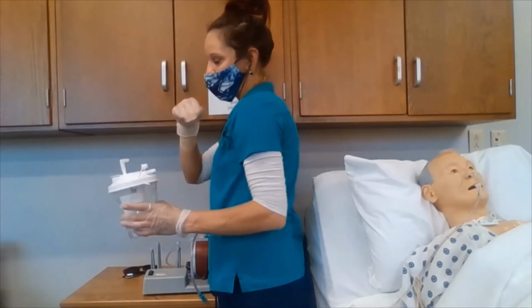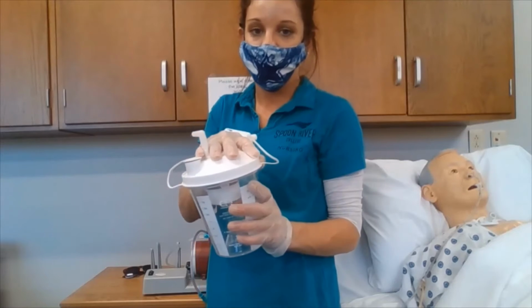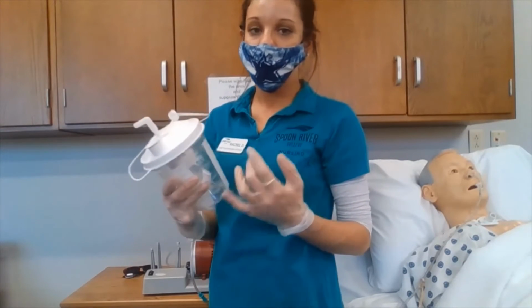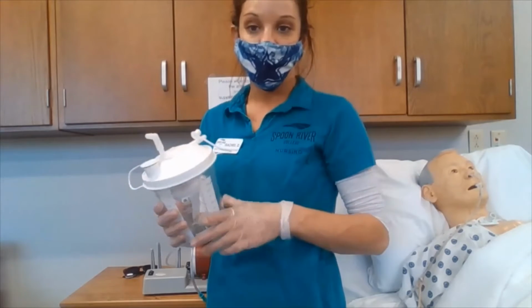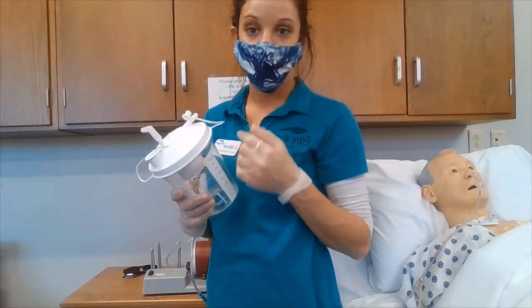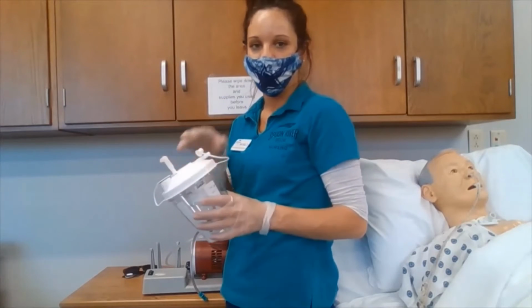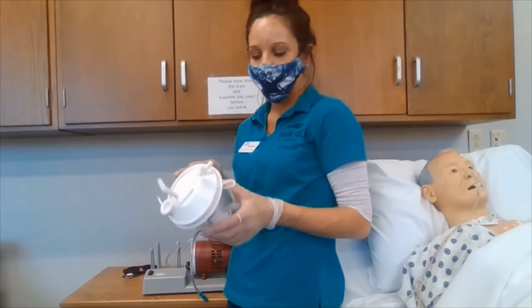We are going to also have a graduated cylinder, and we're going to go ahead and empty the secretions out of that. We are going to be noting the consistency, the color, the amount. We're going to be measuring the amount. We are going to also be noting the odor. After that, we are going to be disposing of the secretions according to agency protocol.